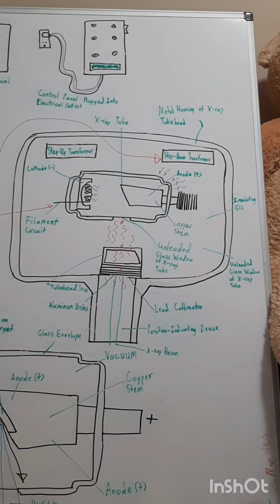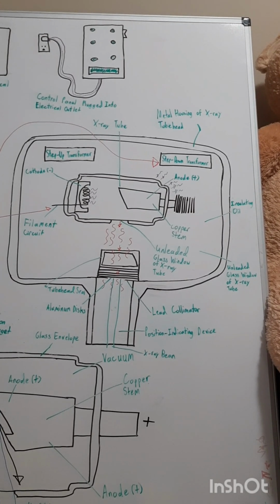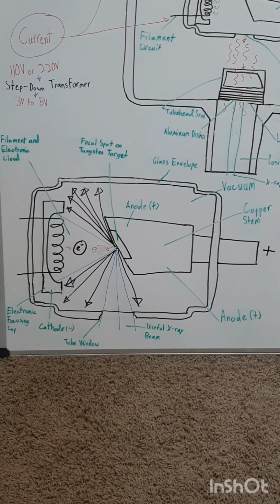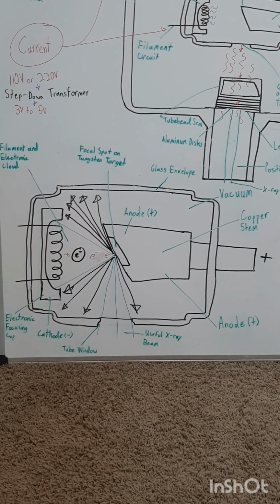Here is a diagram of the dental X-ray tube head with all the parts labeled. Here is the diagram of the X-ray tube with the parts labeled as well.